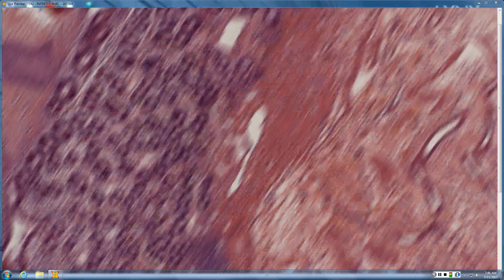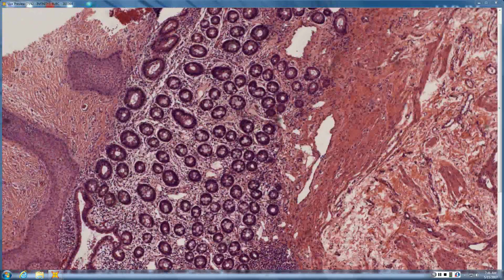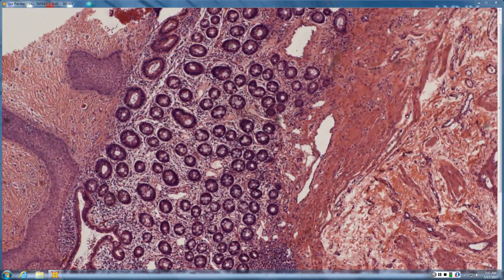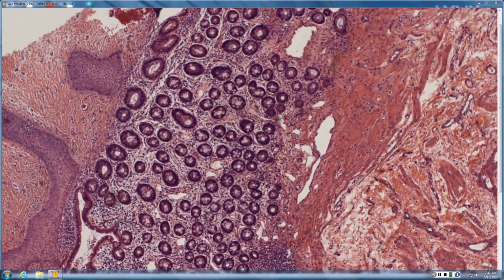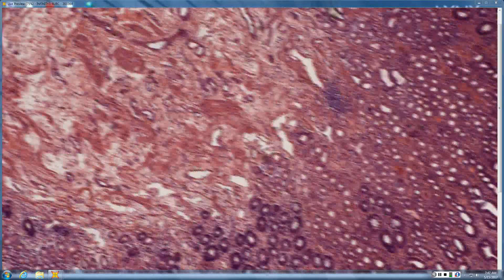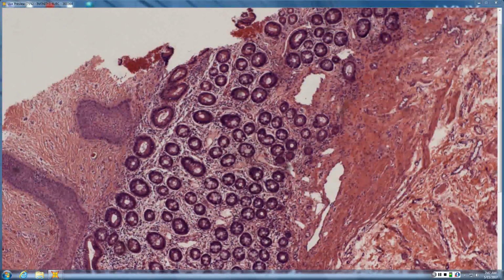So, okay, umbilical papule. Oh, the omphalomesenteric duct polyp. Very good. Very benign-looking gut epithelium with lots of goblet cells. It looks almost like a hyperplastic polyp if you were in gut. Omphalomesenteric duct polyp. Very good. You deserve the easy button as well.